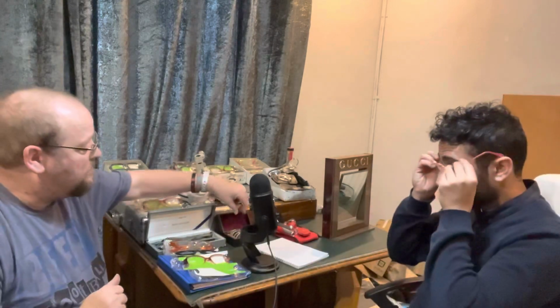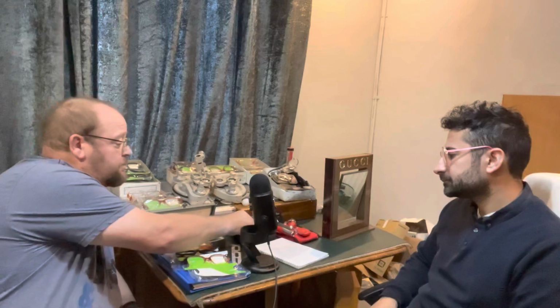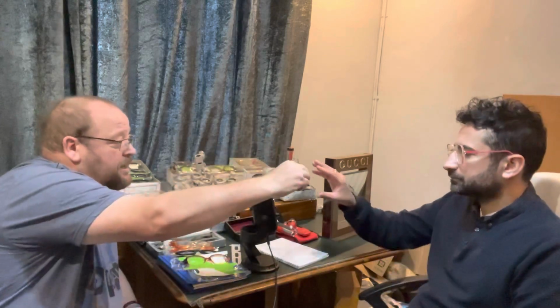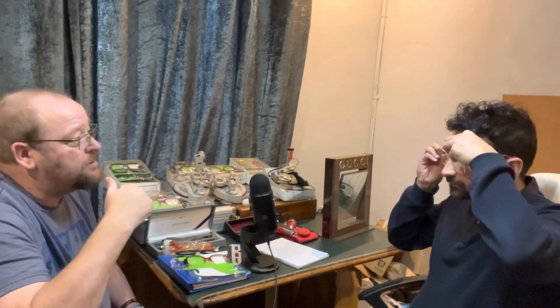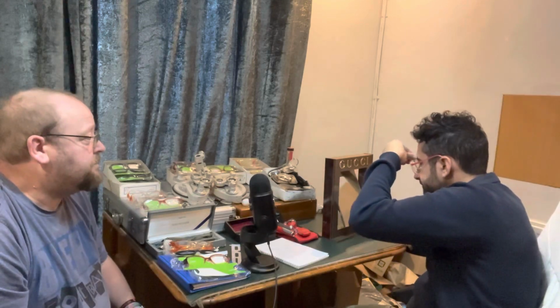I would like you to use one of these aids that we have here. They are dispensing lenses, and what you do is, with your prescription, I'd like you to pick out one of the plus if I pass it to you. If you hold that just inside the glasses, then you can have a look in the mirror, and this will help you to actually see the frame more clearly.